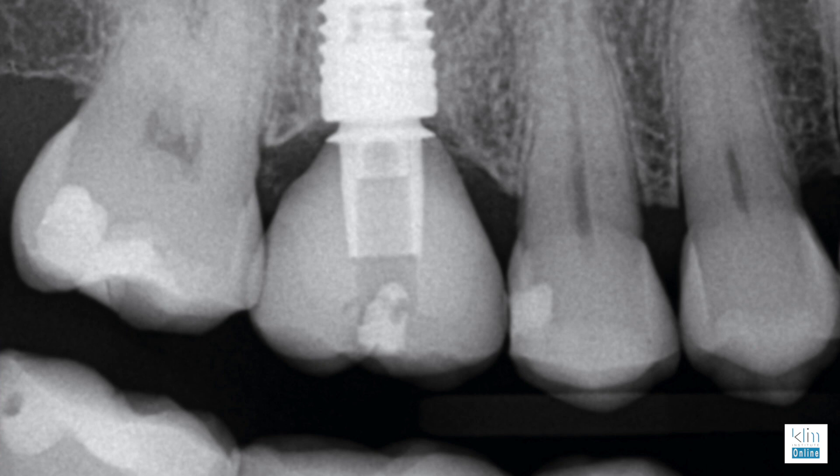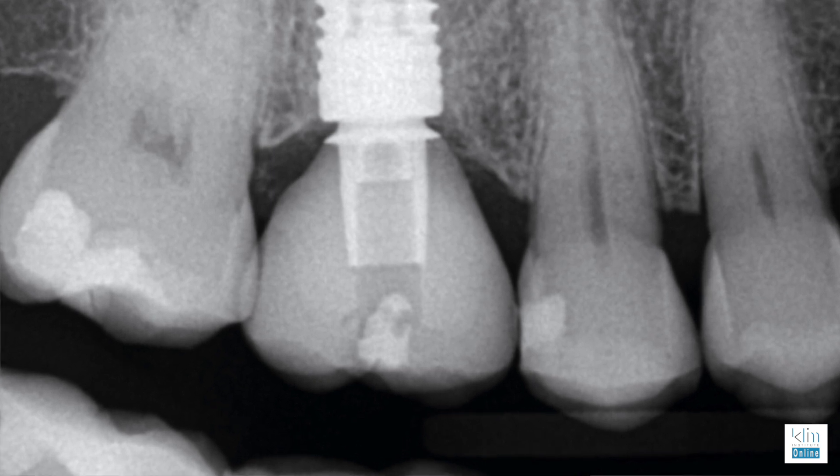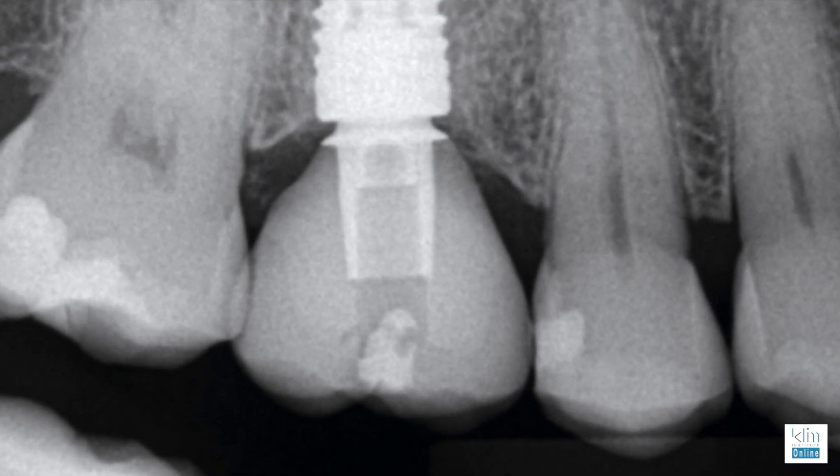Those are the three things that I pay attention to when I'm doing the two-piece. I'm milling out multiple restorations now for my implant class, and I had to go through various parameters to make sure that they seated really well. I've had very good success with my Emax abutments, particularly on molars.